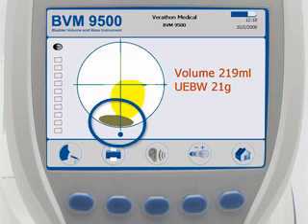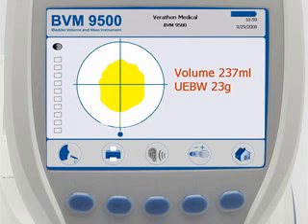By re-aiming, you can ensure you have captured the bladder fully inside the ultrasound cone. If the patient's bladder volume is between 150 and 400 milliliters, the BVM9500 will automatically calculate ultrasound-estimated bladder weight, bladder wall thickness, and bladder surface area.